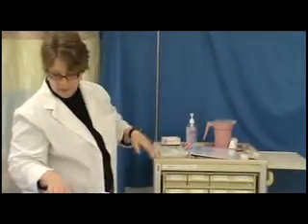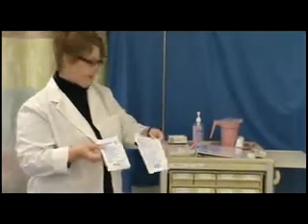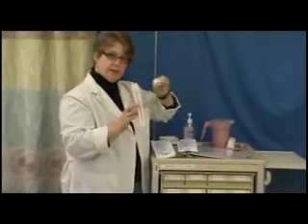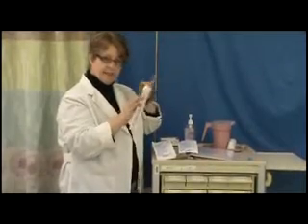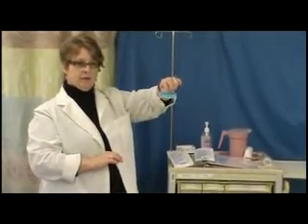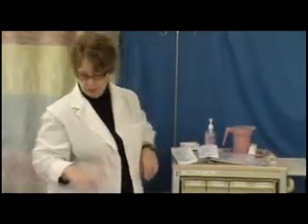Then what we also need are the proper tubings. You need a primary tubing and a secondary tubing. You'll need a timing strip or tape that you can mark on to sort of eyeball, and we'll explain that in class, so I'm just pointing out what you need. And then you're going to need a label for the tubing, a date label, when it needs to be changed.